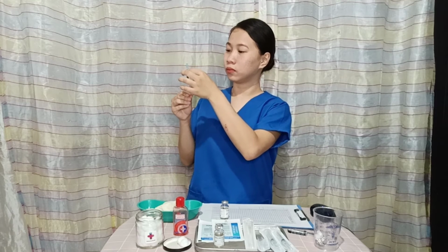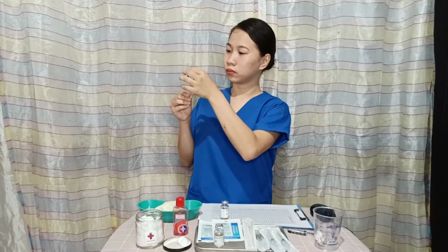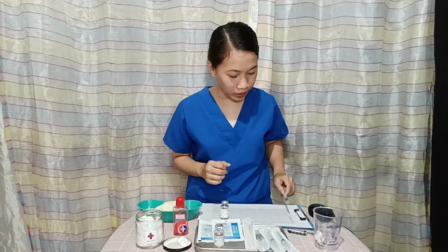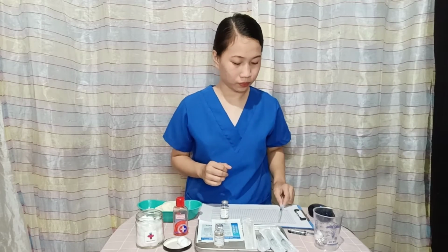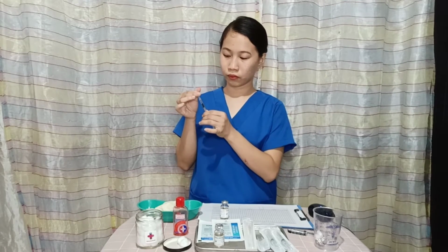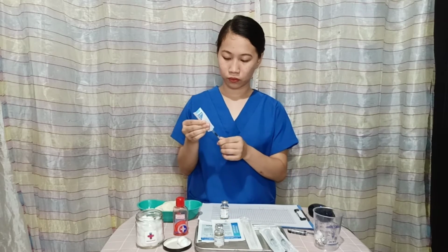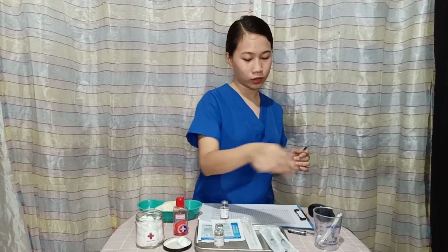Then, tap the barrel to remove the bubble. And replace the aspirating needle with the right size needle that will be used for the actual administration of the medication. We need to scoop the cap and then put it into a waste container.